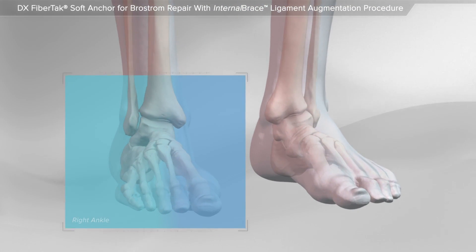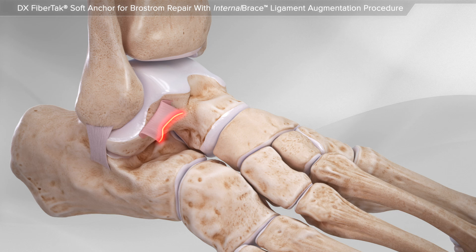In this animation, we will show a Broström repair with an internal brace ligament augmentation procedure. Ankle sprains are very common injuries and some require surgical repair. The Broström repair is the most common technique used to repair the torn ankle ligament.